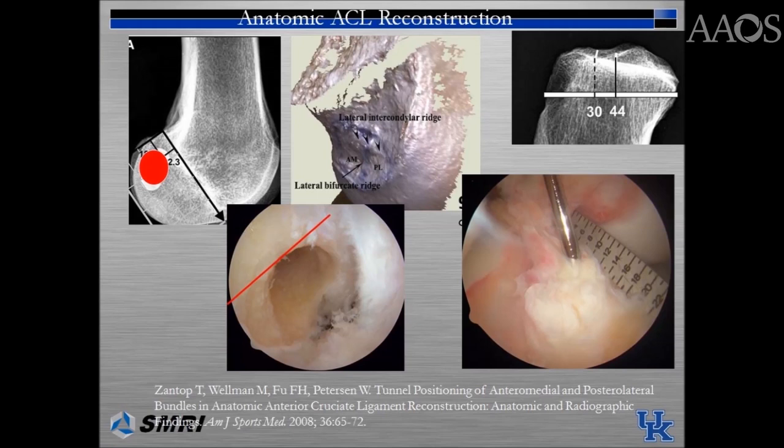The center of the tibial footprint has been described as even with the posterior edge of the anterior horn of the lateral meniscus in the anterior to posterior direction, 15 mm anterior to the posterior cruciate ligament, and 40% of the medial to lateral interspinous distance.